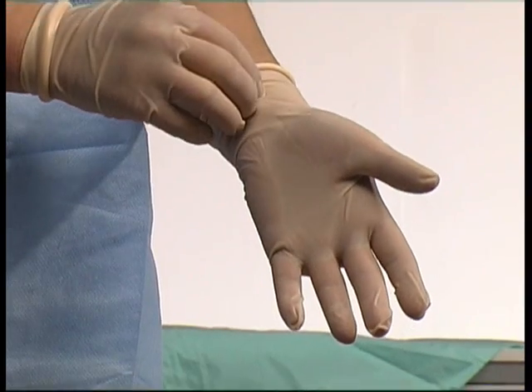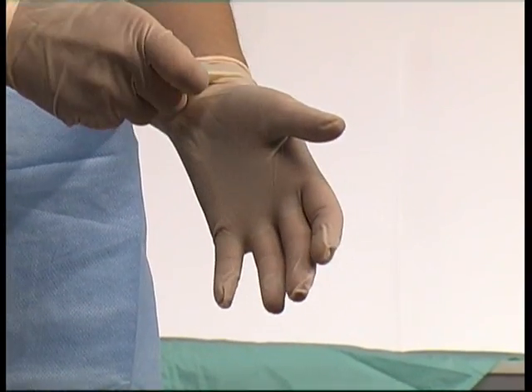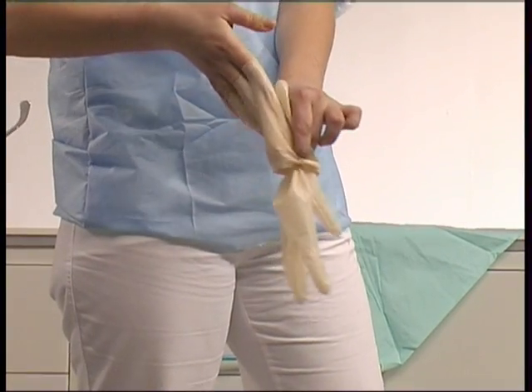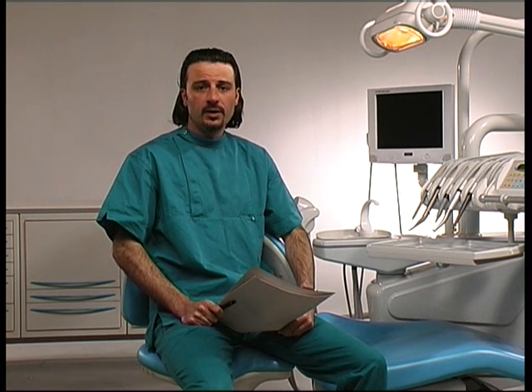The gloves must be removed avoiding contact between the external side and the skin. The Mayo cover may be used as a waste disposal bag for drapes, gowns and gloves. The procedures shown are simple guidelines. With the same main aim of creating an aseptic environment, your own experience may require a modification of the protocols. Omnia is specialised in the manufacture of customisable sterile sets designed for the specific needs of the surgical team.